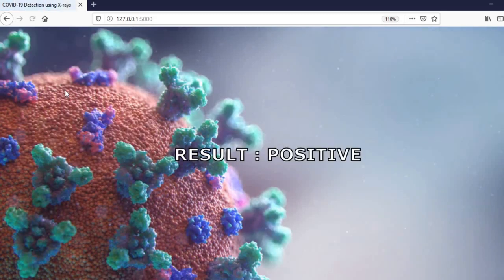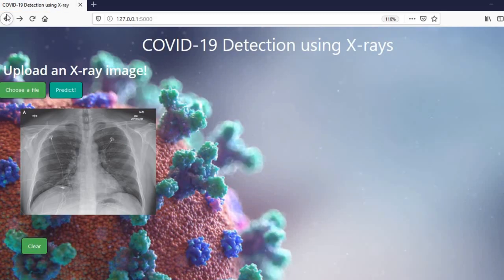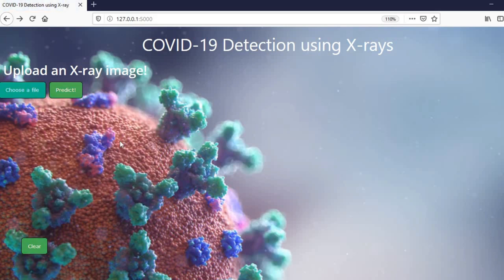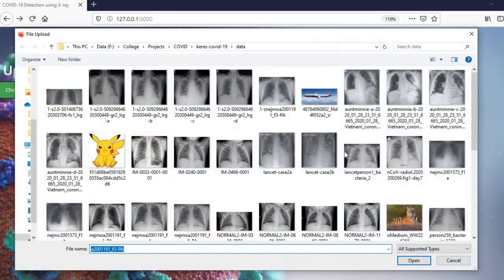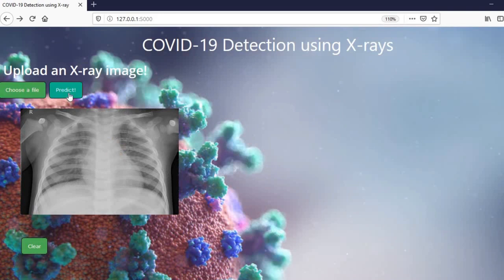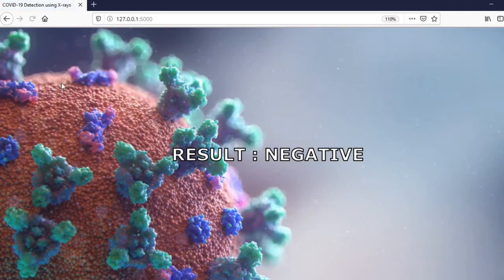We have got a prediction that the result is positive. Let's try some other image. We will predict on this, and here we have our result.